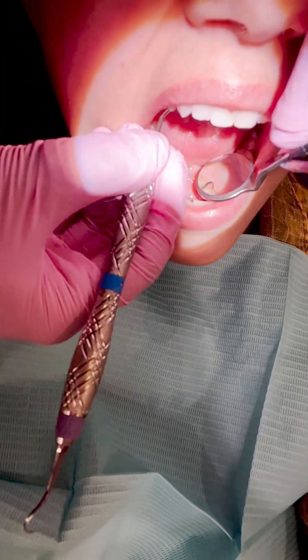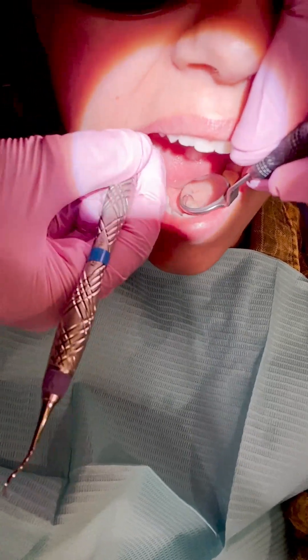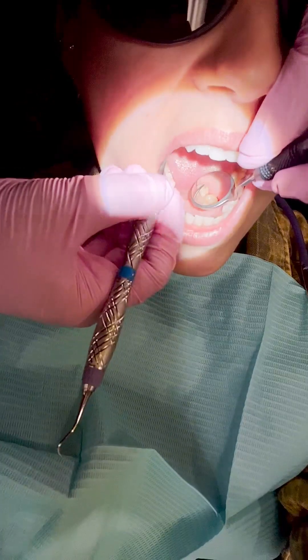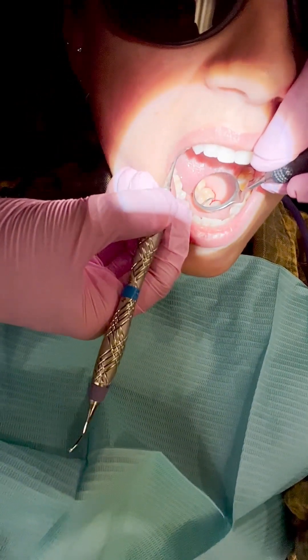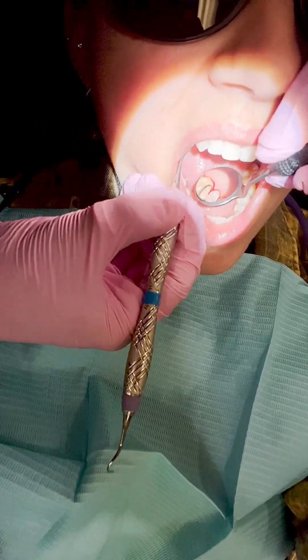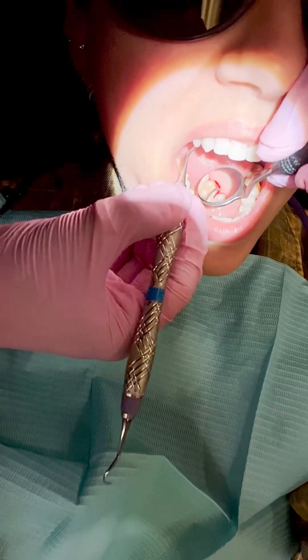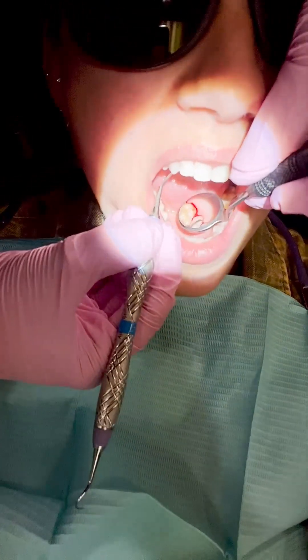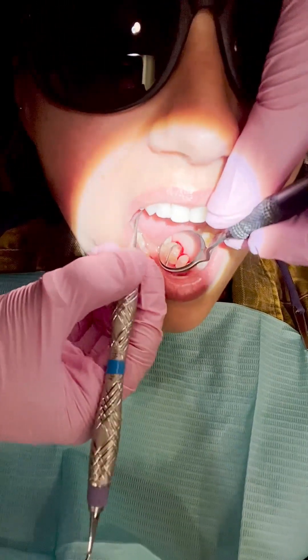I use my nevi for the lower anterior teeth and the linguals of the upper right. For the linguals of the upper right, I don't need the extended shank. It's a lot harder to use the extended sickle there. The nevi is smaller and more controlled — it's a lot easier, and you'll have better control of the instrument if you switch to a nevi during this part.